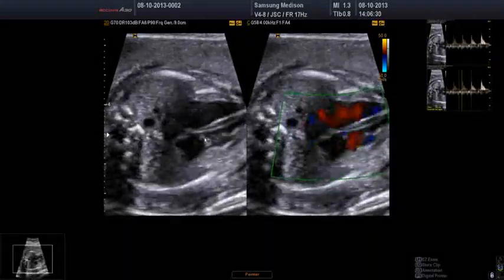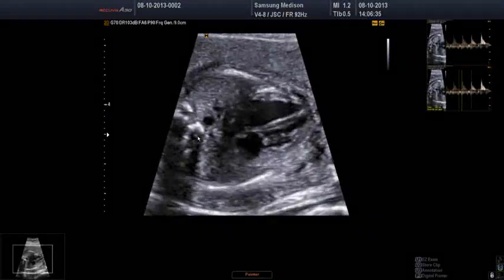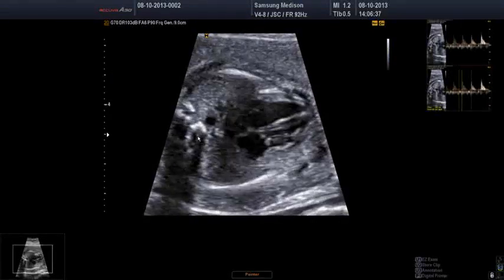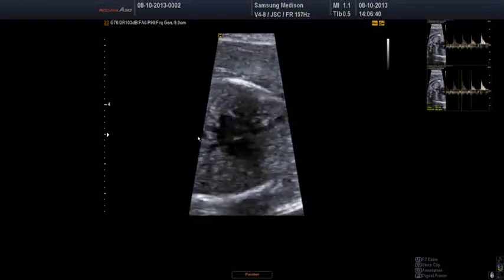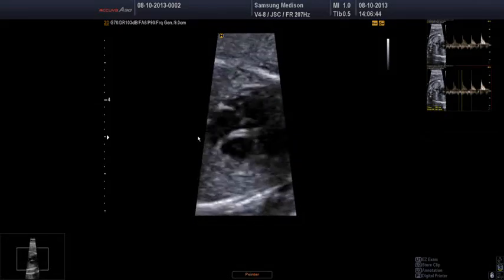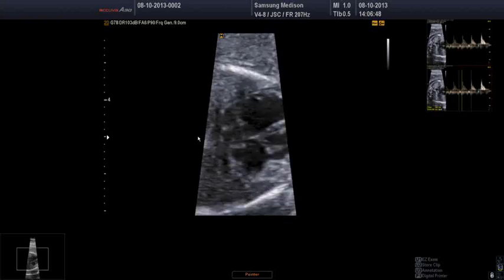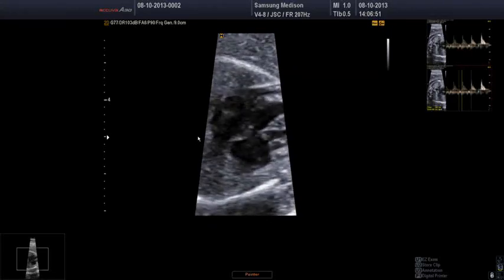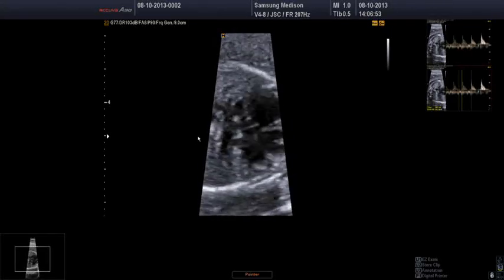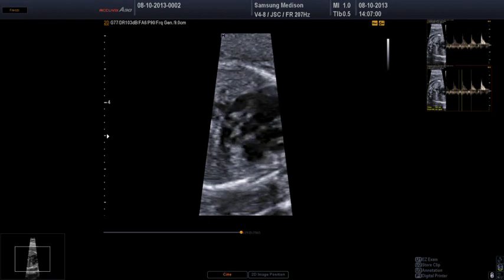And if you have an image on the other side, maybe I will come out of this and I will narrow the sector a bit more, because if I'm interested in the aorta and aortic valve, the closer I get to that and the bigger I make it, the more details you can get of what you're interested in. And if you're interested particularly in the aortic valve, then you'll come out of the zoom just a tiny bit. And then you can freeze and look back at that left ventricular outflow tract, where you have here a continuity between the septum and the aorta.